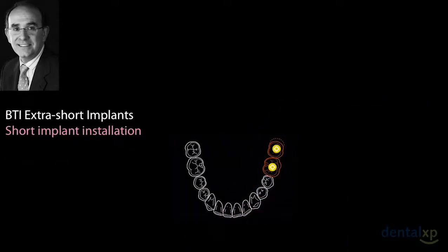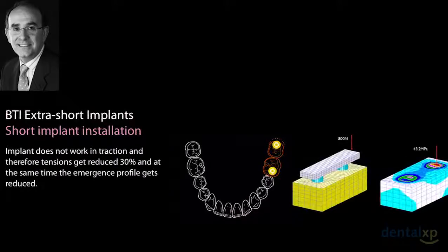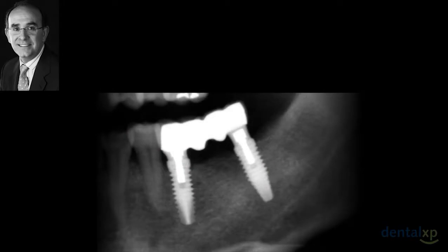If you place two implants with two single crowns, the position of the implant will be in the middle. The advantage of splinting is that you can place the implants at the extremes, so you always reduce the tension and obtain even better hygiene and a better biomechanical result.